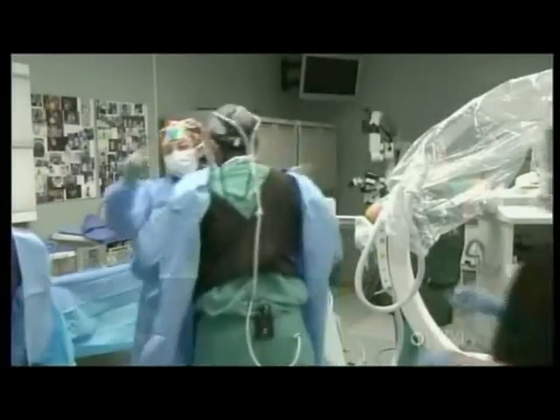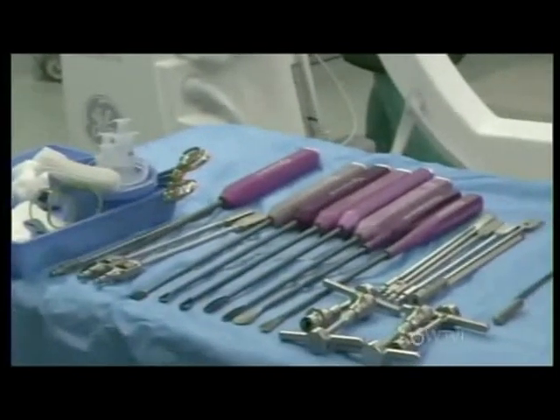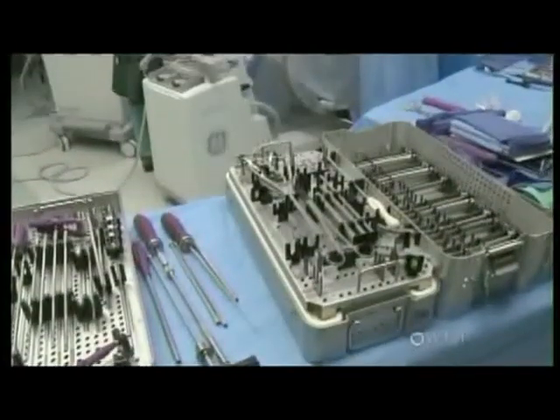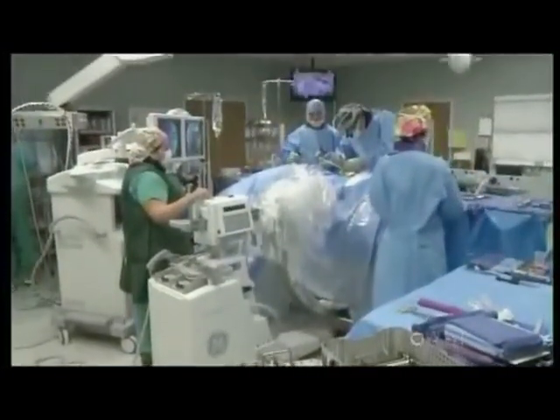There's a large operating room staff that we need. We get scrubbed up — you can see the instruments that are there — and from that standpoint, the patient's in proper position. Once the patient's in proper position, we go ahead and proceed with the surgery itself.